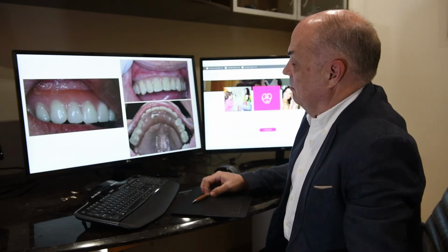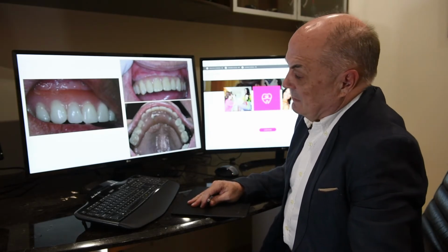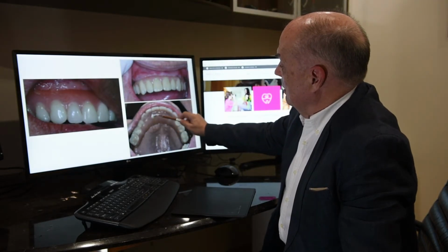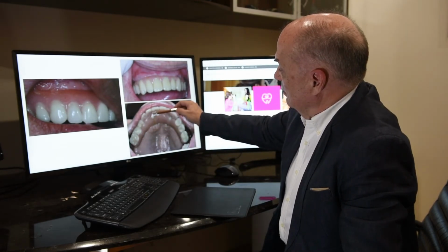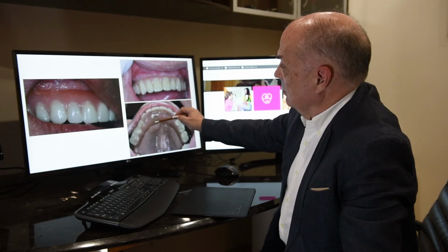And the other very popular thing at the moment is the same day teeth, or teeth the next day. And so what they're doing is they're getting some laser welding of some metal framework and then bonding basically denture teeth on. If you look very closely, this is one that was done in another practice, and after a couple of years we already have a crack in the framework.